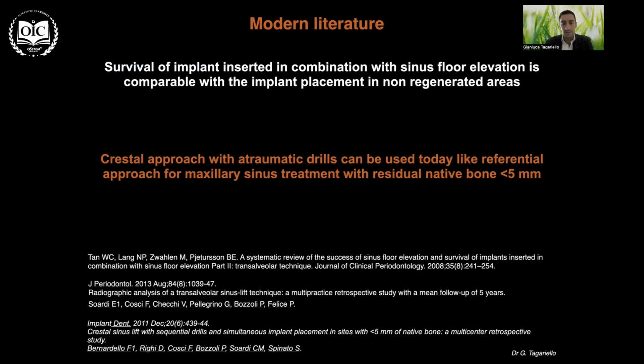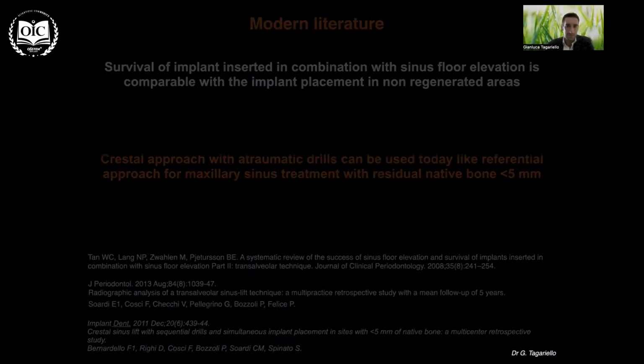But as I have already shown you, I try to use this technique even when I have 3 or 2 millimeters. And when I have only 1 millimeter of residual bone, I decide to put only the bone inside the sinus. After a period of 6 months of regeneration, I decide to insert the implant for safety.